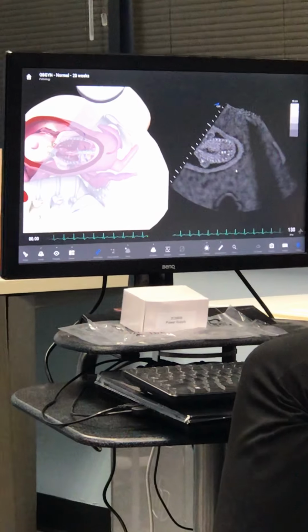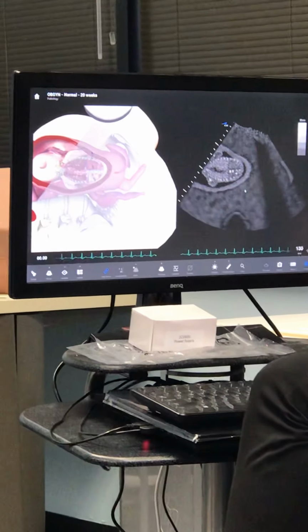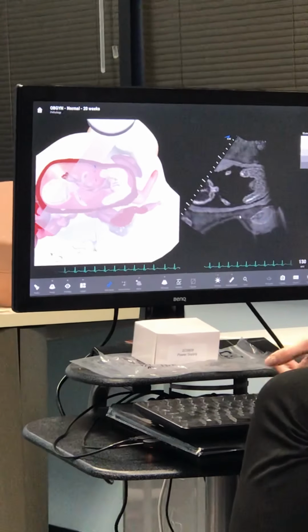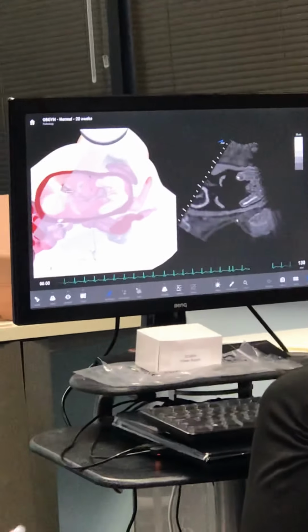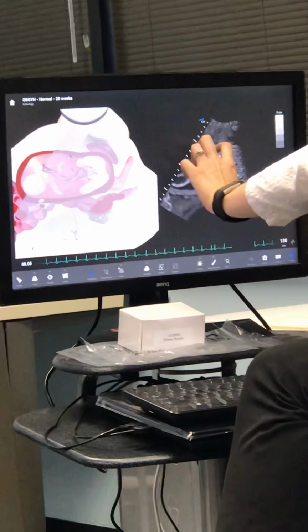Yeah. Because otherwise you can end up measuring the same pocket twice and you can overestimate your fluid. So you want to stick to, and you also don't want to go too far midline because now you're no longer in a quadrant. That's what I was talking about. Like, freeze it really quick. You're not in a quadrant anymore. Well, maybe not that exact picture, but like you know how like before you had like in between the head and the little legs. Yeah, I would measure down here. So you measure the whole thing. That's what I was talking about.